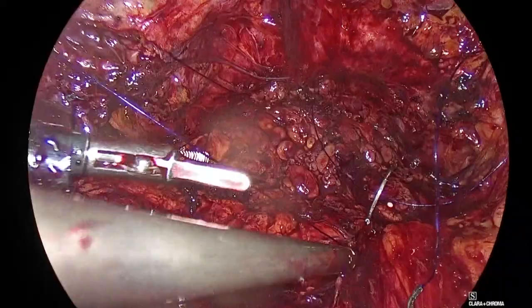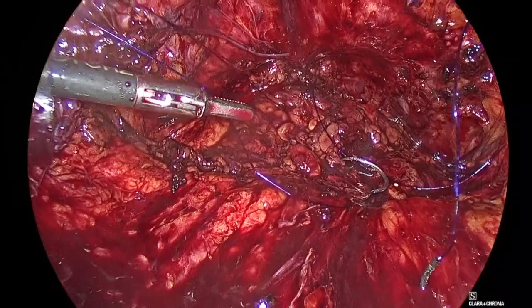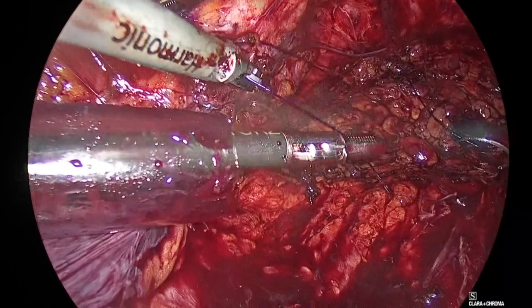You will see how the final stitch is an inside-out on the bladder on both sides. So it shrinks down the bladder. The anterior bladder neck comes down. I never reconstruct it.